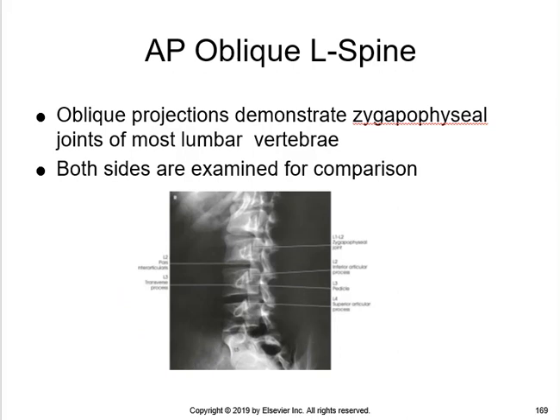So on both the C-spine and L-spine, the anatomy of interest for the oblique was, for AP projections for the C-spine and T-spine, the anatomy of interest was on the upside. On the C-spine, again, it was the intervertebral foramina on the upside, if we had the patient in an AP oblique. On the T-spine, it was the zygapophyseal joint still on the elevated side. On the L-spine, the AP is going to show us the zygapophyseal joint on the side closest to the image receptor.